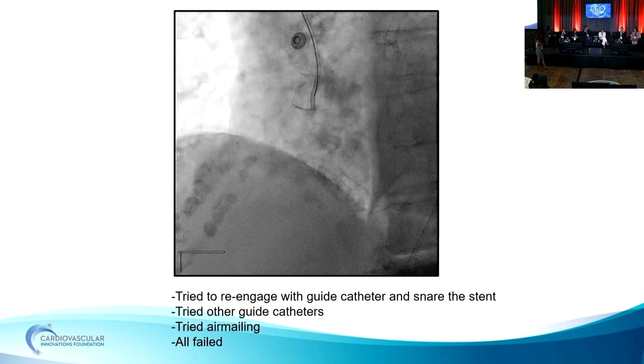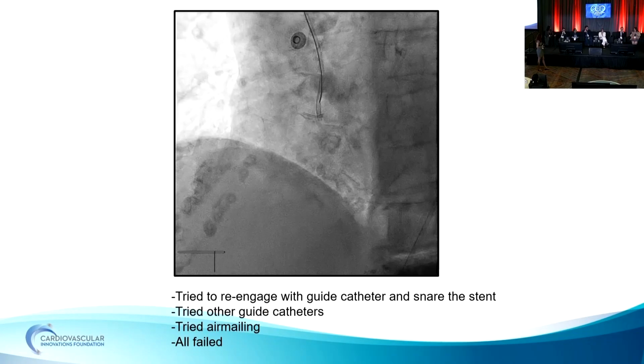But I think, recognizing where you're at a high-risk moment, which obviously you did, taking the time to swap the wire out can be helpful to try to keep your gear in when you're fighting your guide the whole time.